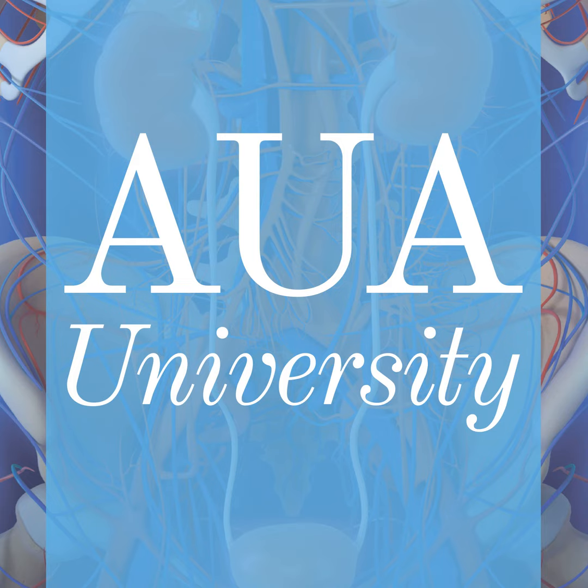So I just want to go a little bit more into detail. How do I select patients who might be candidates for radical salvage prostatectomies? Right now we have done more than 400 of those cases, so we're probably quite experienced in this setting. So this is what I do in my patients. Usually I get a PSMA PET scan to rule out locoregional and systemic metastases. And we also use the multiparametric MRI and the PSMA PET scan to rule out extraprostatic extension.